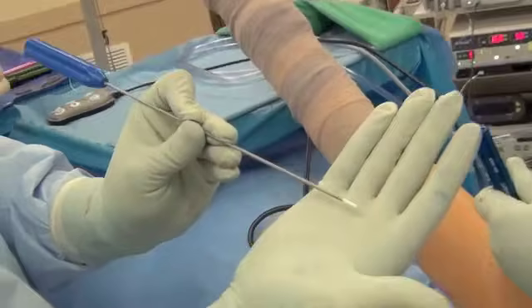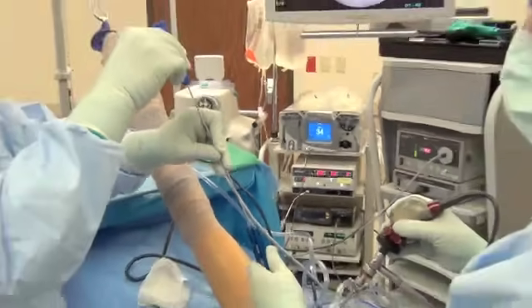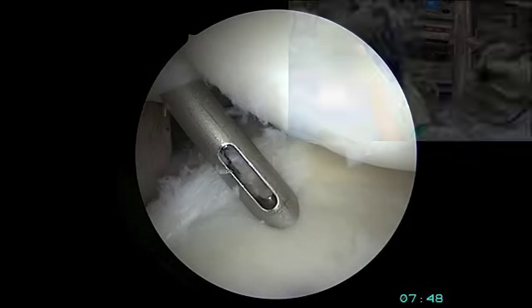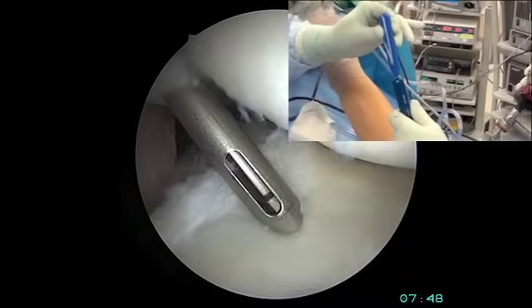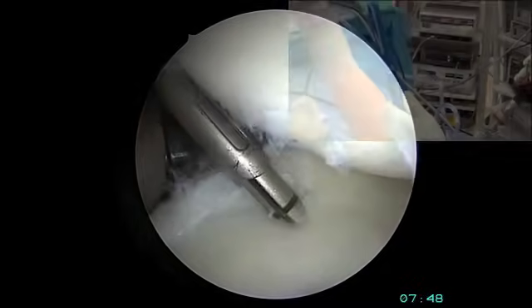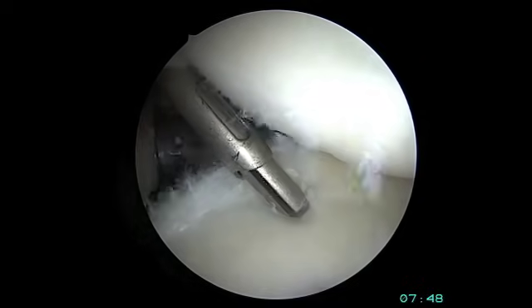The suture anchor is a bioabsorbable, very strong device that's placed into that pilot hole through the guide and then tapped into place. It has very strong suture attached to it, and you can pull on that suture to confirm the anchor is well fixed into the bone.